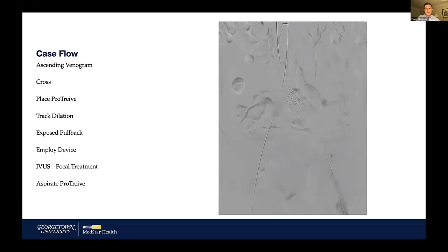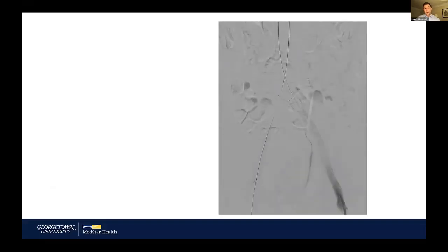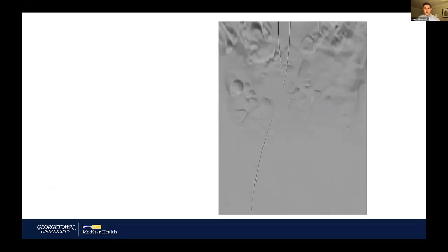After a bit more work, all the material that was on the end of the stent was mobilized. There are very limited irregularities left in the majority of the iliac stent. I've been continually aspirating material out, though some material remained residually within the Protrieve sheath and was continued to be aspirated. Ultimately, I thought we had a great result. This is our completion — very brisk flow. I performed IVUS and did not feel it was necessary to extend the stent, and we had excellent stent-to-vein sizing.